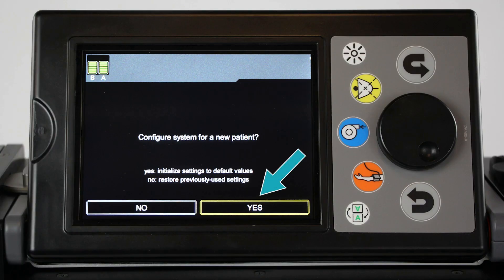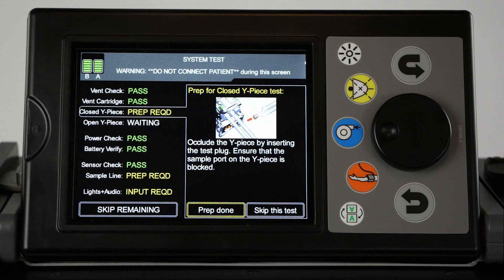If prompted to configure the system for a new patient, select Yes. The system test screen is displayed. Some tests are automatic and do not require any user input. Others require some feedback or preparation and will state input or prep required. Use the jog wheel to navigate through the tests and select the various options.